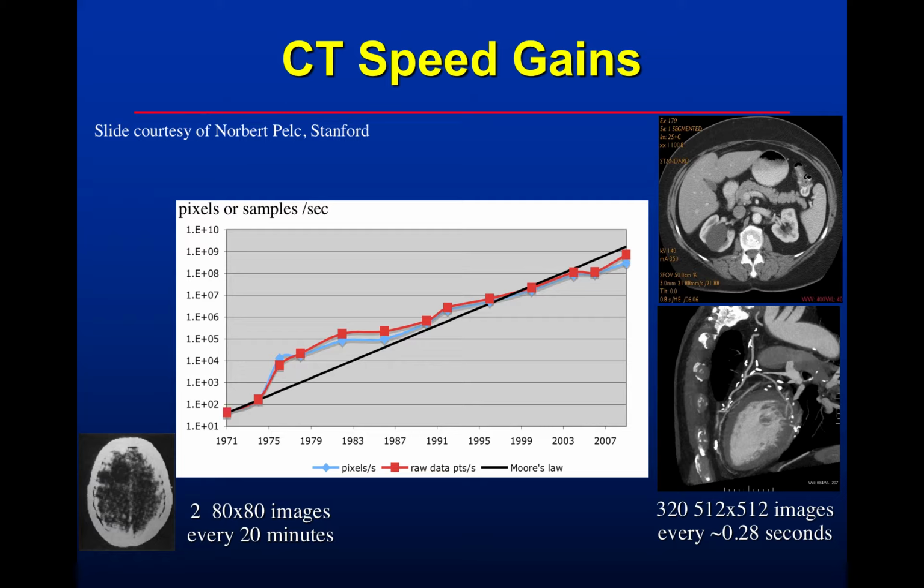And so that's when Hounsfield did it, they basically took all this data and fed it into a huge array processor to do an inversion of the whole thing. They didn't do convolution back projection or anything. And it took days to compute the first images.